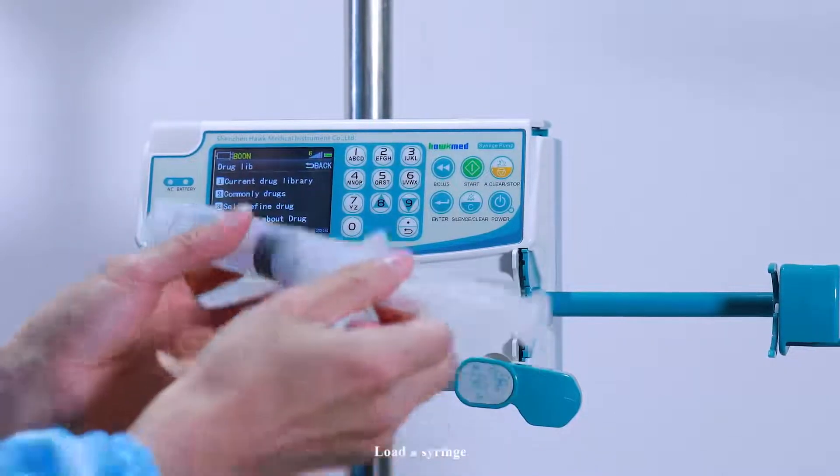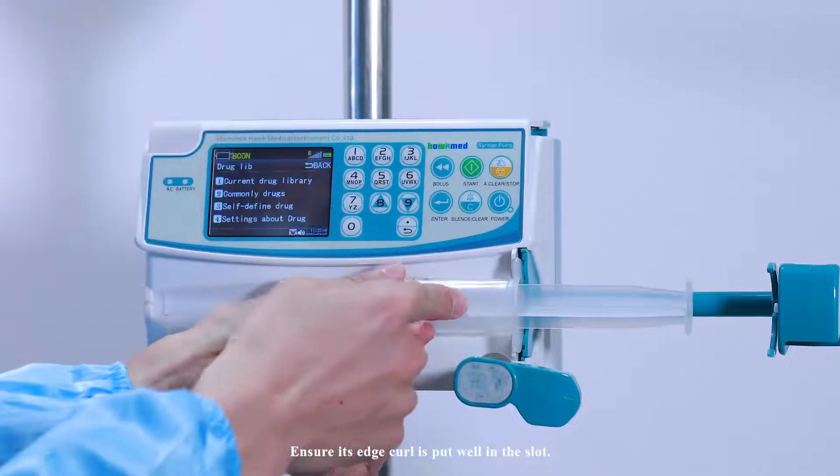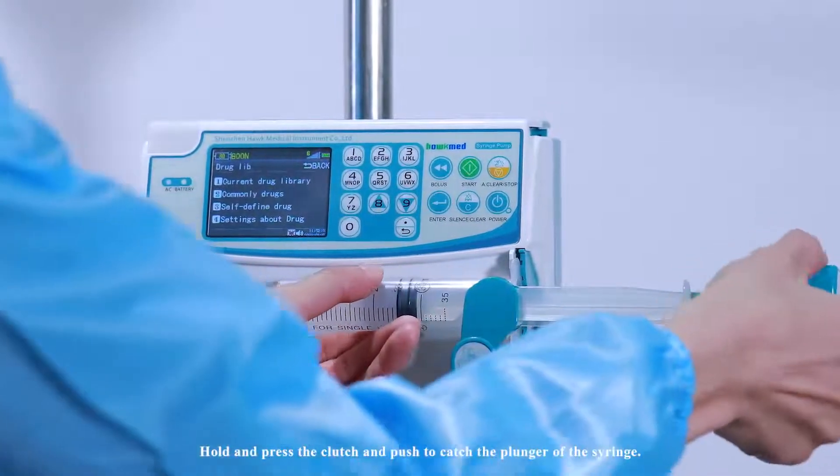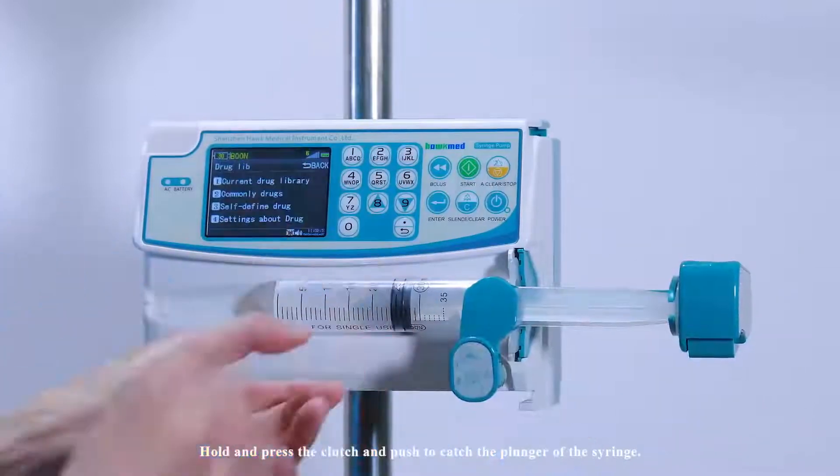Load the syringe. Ensure its flange is put well in the slot. Hold and press the clutch and push to catch the plunger of the syringe.